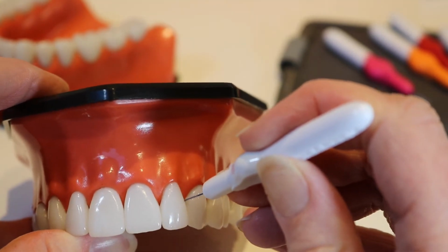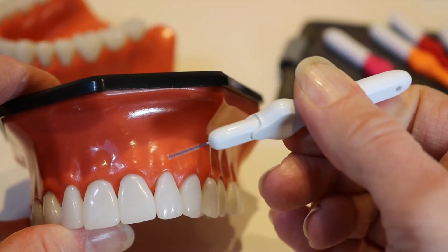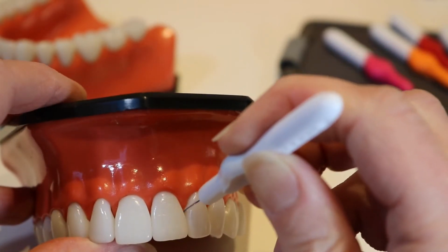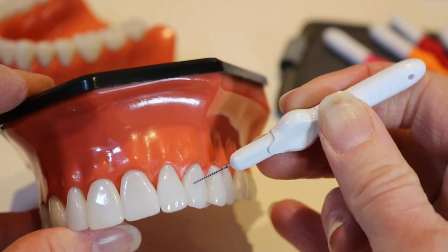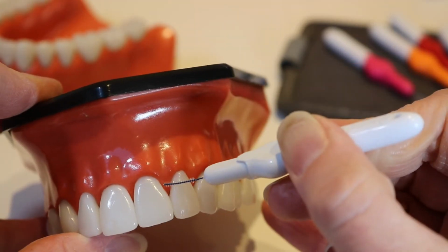And I probably could put it through there, but it would be forcing it to go through, which would damage the gums, and we do not want that. And same in this gap here, we do not want to damage it. So we would use floss in this gap here and this gap here.